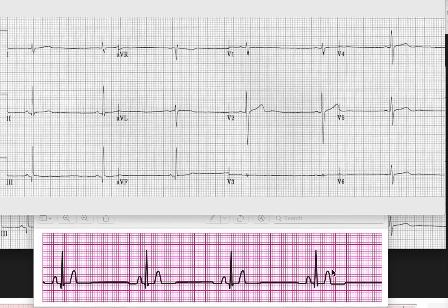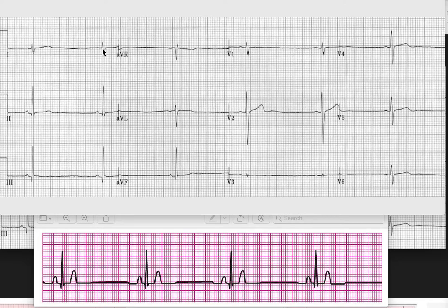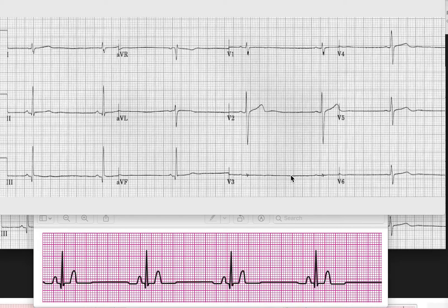This appearance may not be the same in every lead. If you look here, you see in lead 1, 2, and AVL, you are seeing an upright P-wave — this is also sinus bradycardia, and you can see how slow the heart rate is going. The P-wave in AVR is inverted. So it is upright in some leads and downward in AVR. It depends which lead you are looking at.